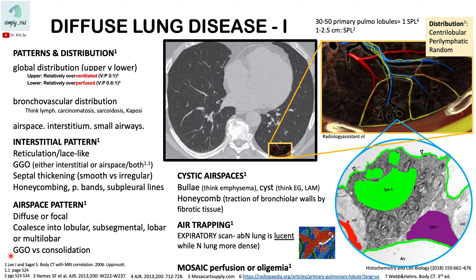Differentiating ground-glass opacification versus consolidation: ground-glass opacity is when you can still see the airways or vessels through that area of increased attenuation. Consolidation means you can no longer see the vessels or airways through it.